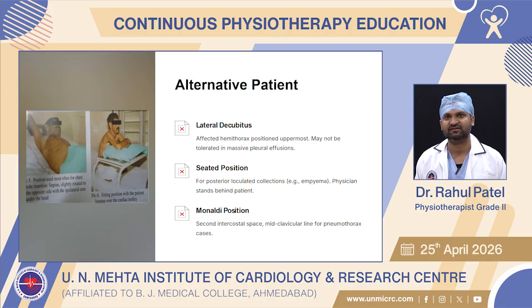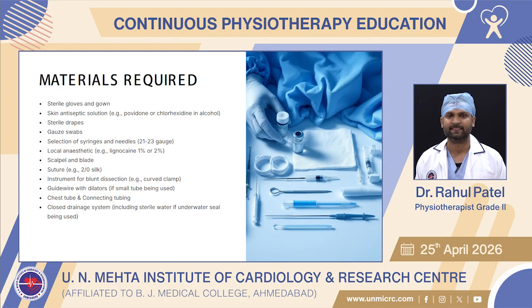Alternative patient position: lateral decubitus with affected hemithorax uppermost, which may not be tolerated in massive pleural effusion. Seated position for loculated collection or empyema, with physician standing behind patient. Monaldi position: second intercostal space, mid-clavicular line for pneumothorax cases.